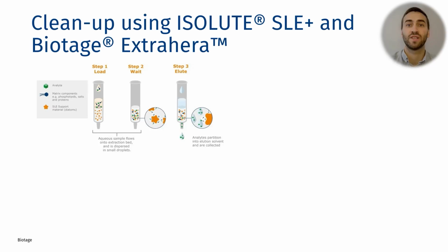The extraction efficiency is dependent on the solubility of the analytes in the elution solvent. So the aqueous sample is loaded onto the bed and left to wait for 5 minutes. The sample is dispersed into small droplets on the bed, and then a water-immiscible solvent is passed over this, allowing the analytes to partition from the bed into the elution solvent.